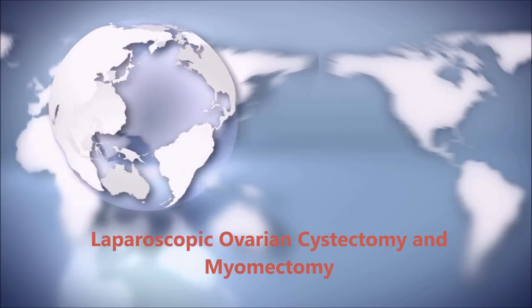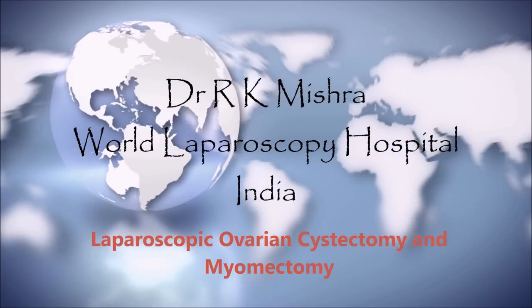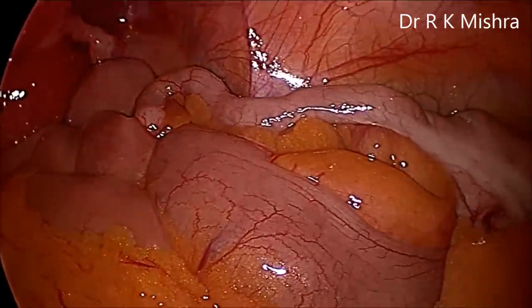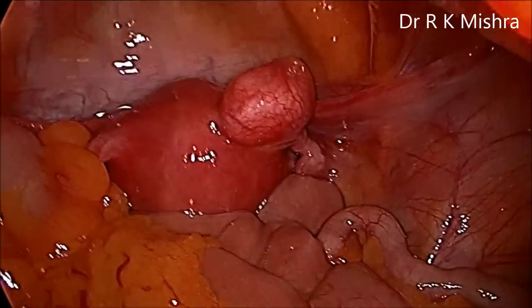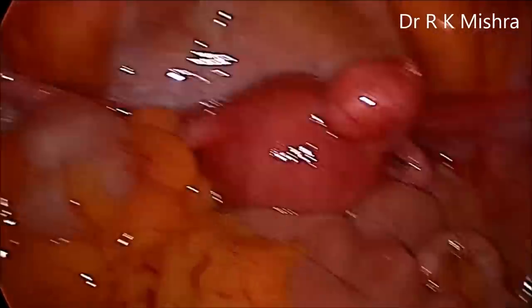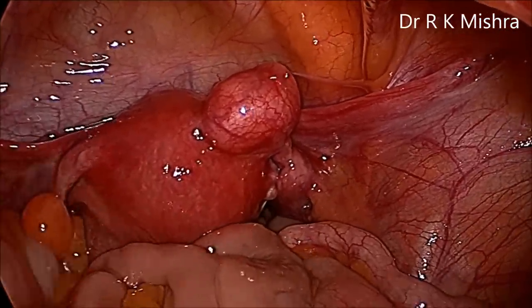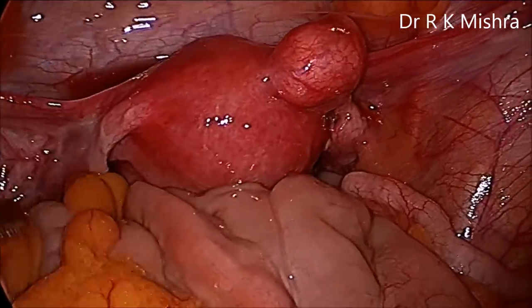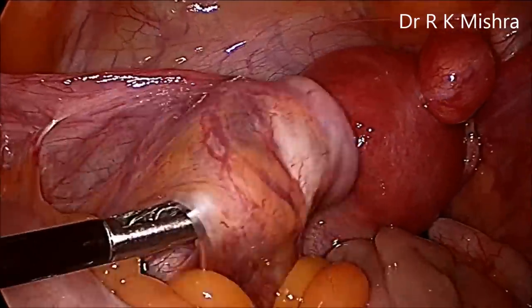This is a case of laparoscopic ovarian cystectomy with myomectomy. This patient has one 6 cm diameter dermoid cyst, together with two big myomas. Both the myomas are sub-serous. One sub-serous myoma is approximately 4.5 cm, visible just in front. Another is on the posterior wall of the uterus, and that one is intramural. This patient also has infertility, so we will do a tubal patency test as well.